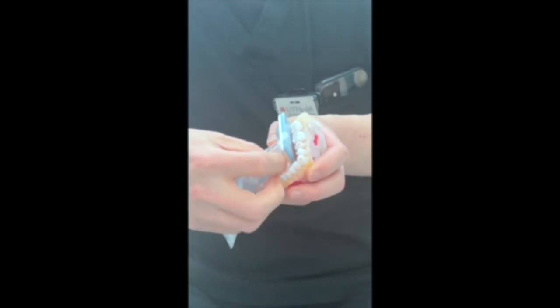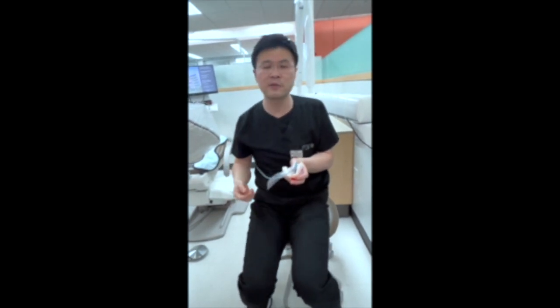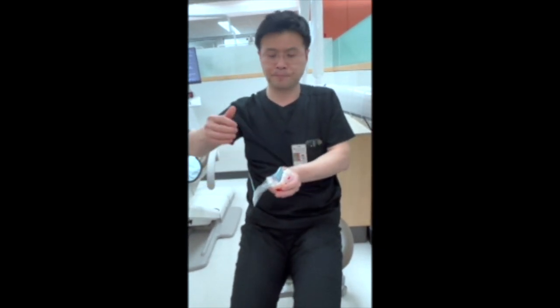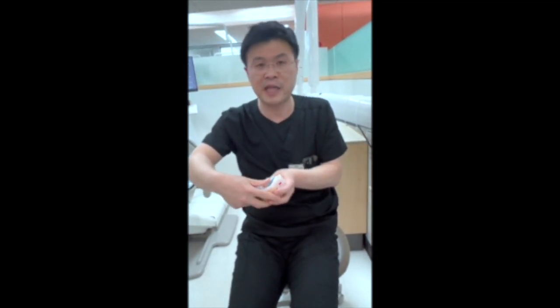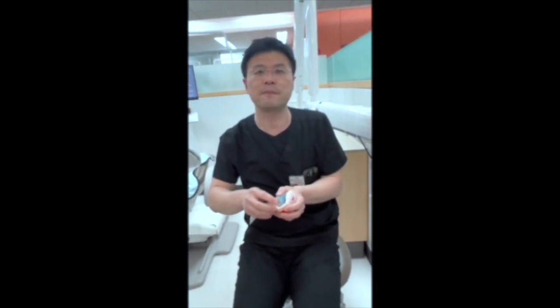And after that, expect that when you push down, the patient may react. It may not necessarily be the patient reacting. It's really the mylohyoid muscle reacting. It's just a very common reaction. So when you push it down, be gentle with the patient. It's very common.